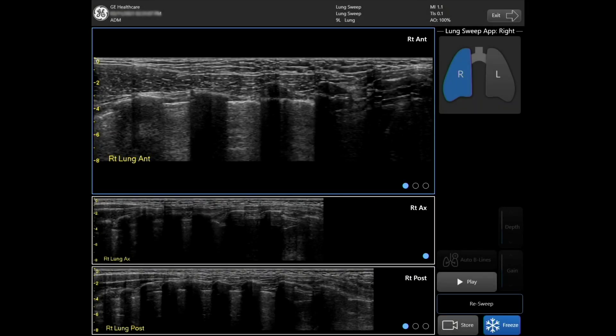Lung Sweep is a rapid visualization tool that provides a dynamic panoramic view of the entire lung to help the clinician assess lung conditions. The Lung Sweep tool is available on all Venue family linear probes as well as the C1-5 RS transducer. The Lung Sweep tool can be used for pediatric and adult patients.